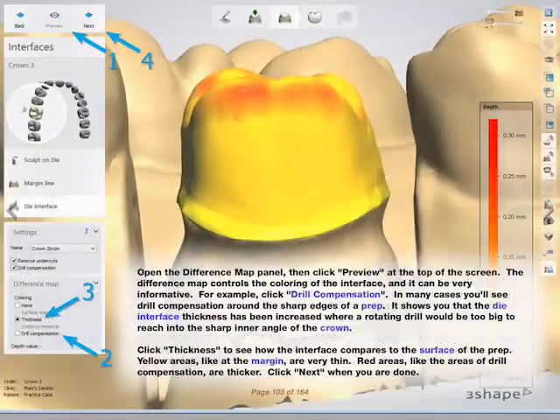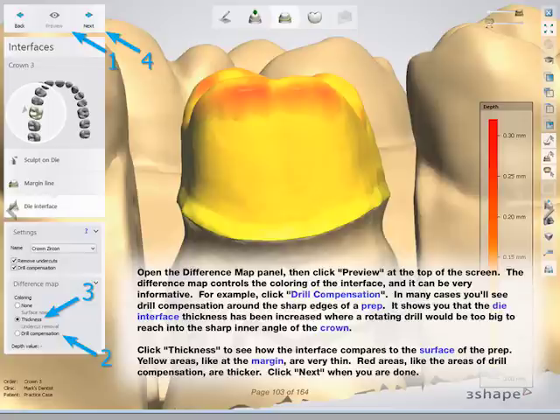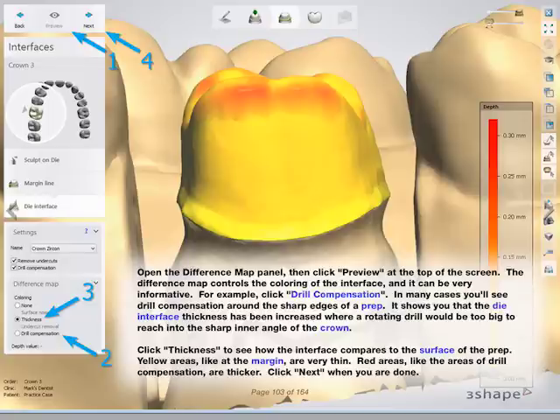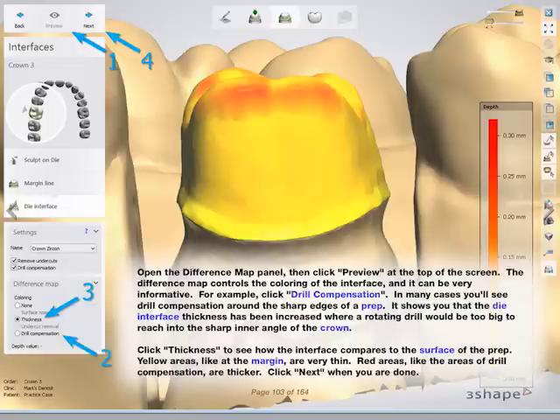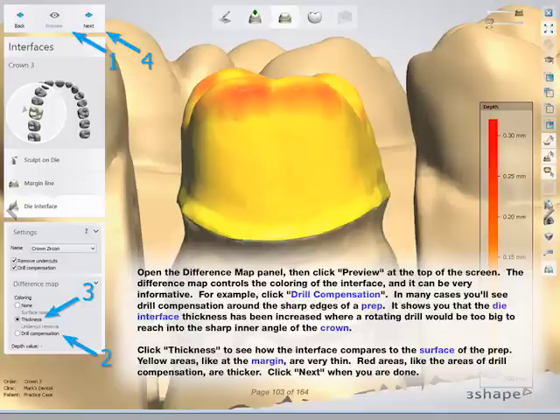Open the difference map panel, then click Preview at the top of the screen. The difference map controls the coloring of the interface and can be very informative. For example, click Drill Compensation. In many cases you'll see drill compensation around the sharp edges of a prep — it shows you that the die interface thickness has been increased where a rotating drill would be too big to reach into the sharp inner angle of the crown. Click Thickness to see how the interface compares to the surface of the prep. Yellow areas, like at the margin, are very thin. Red areas, like the areas of drill compensation, are thicker. Click Next when you are done.